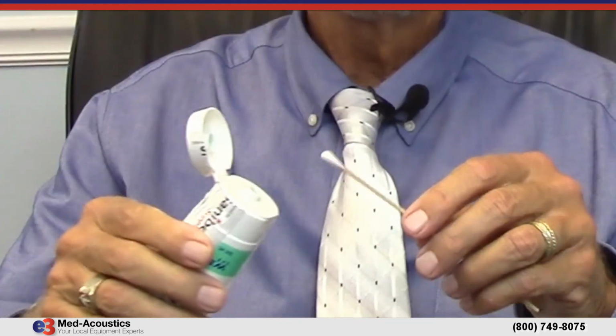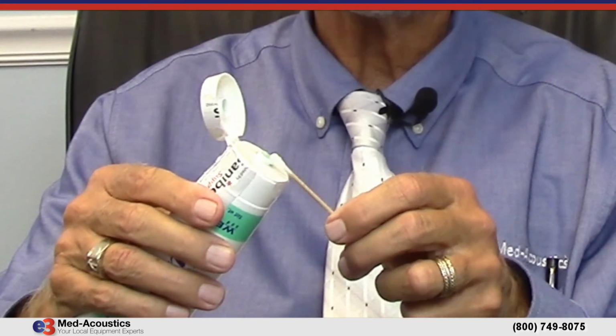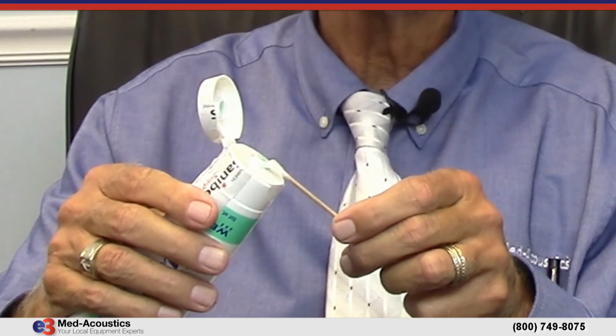I like to do two things. I like to degrease and abrade the external meatus. And the way that I degrease is simply by applying some alcohol to the Q-tip, like I'm doing now. You can just dip it in isopropyl alcohol. And the next thing, very, very important, is to use NuPrep. So I take some NuPrep and I just take a little dab of it, and I make sure I've got it really pretty good on this Q-tip, but not so much that I'm going to occlude the ear canal with it. Right? Then I'm cleaning nice and deep.